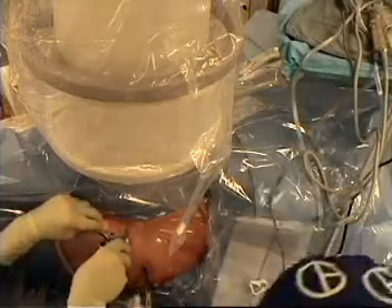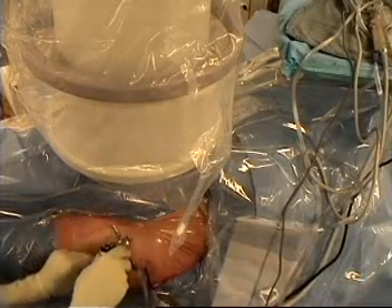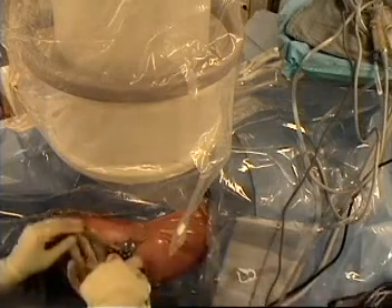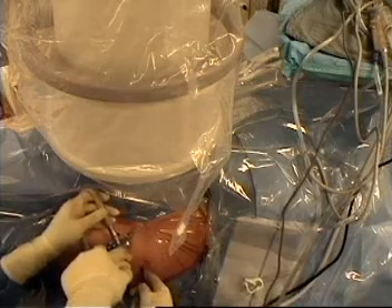We are going to go inside your hip. You can see inside your hip the cartilage looks good. I am going to put this in here and take a look way at the bottom, just to see where we are coming in and through. There it is.